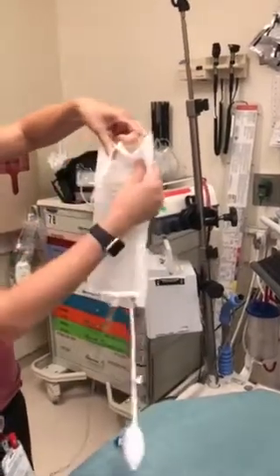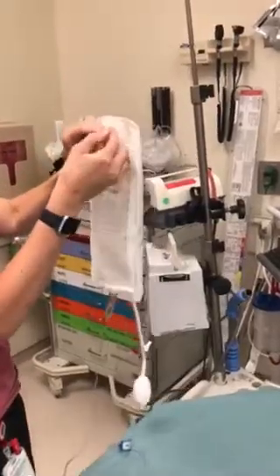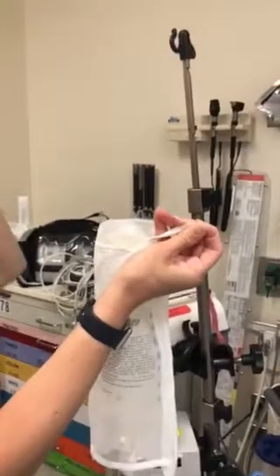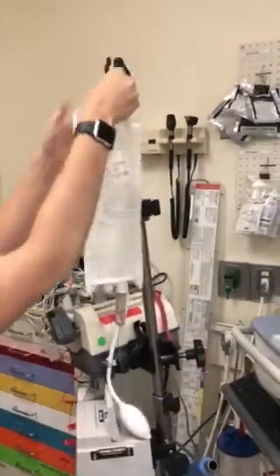It's easier if you reach your hand in and kind of shimmy it up a little bit. Once you do that, another important step is to make sure that you loop it through this little tab. If you don't, and you loop this part to that, your pressure bag will hang a little bit lower than your normal saline bag. Go ahead and hang this up.